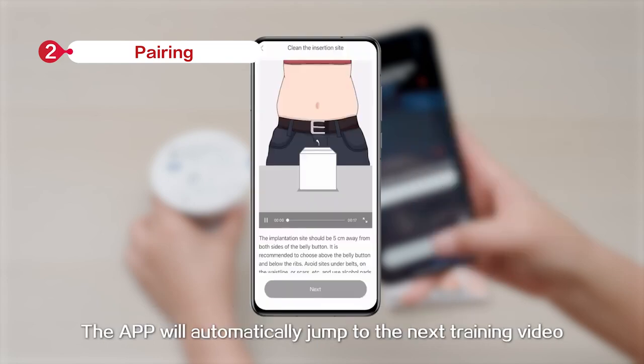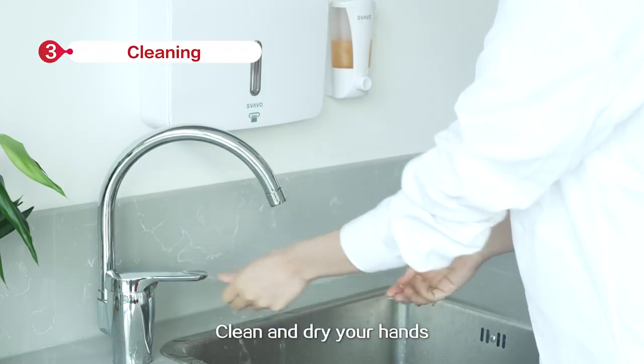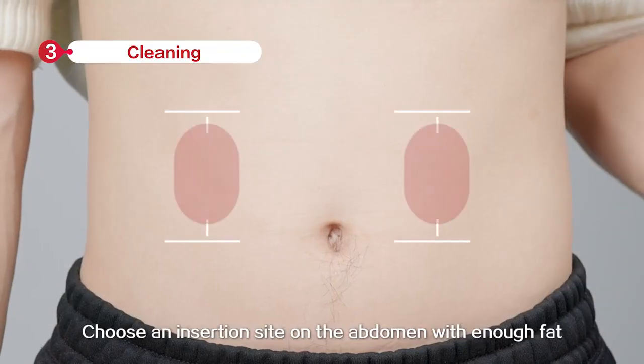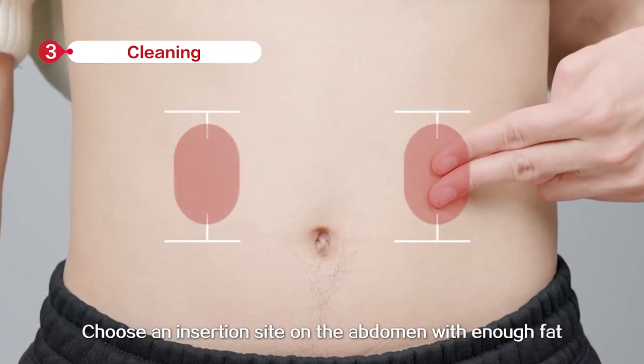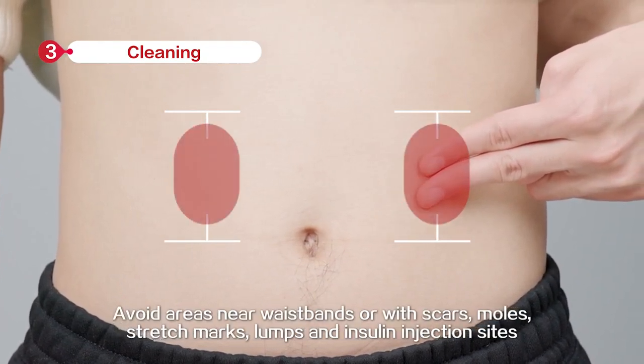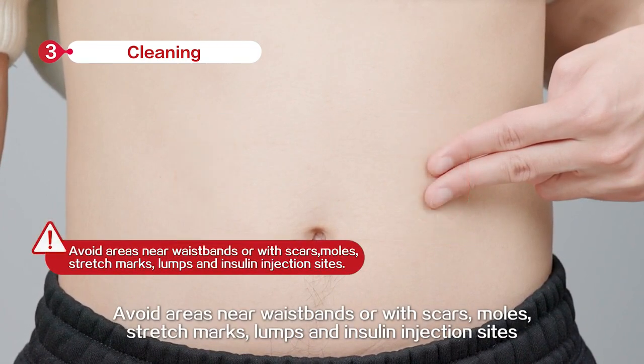The app will automatically jump to the next training video. Before you begin, clean and dry your hands. Choose an insertion site on the abdomen with enough fat. Avoid areas near waist bends or with scars, moles, stretch marks, lumps, and insulin injection sites.